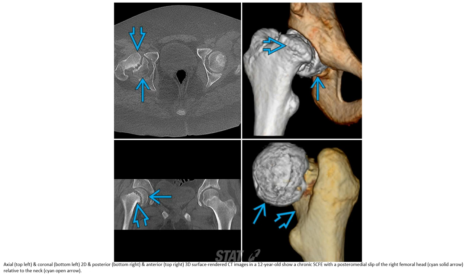This shows axial (top left), coronal (bottom left) 2D, and posterior (bottom right) and anterior (top right) 3D surface-rendered CT images of a 12-year-old patient. This is a chronic slip capital femoral epiphysis with a posterior and medial slip of the right femoral head relative to the neck.